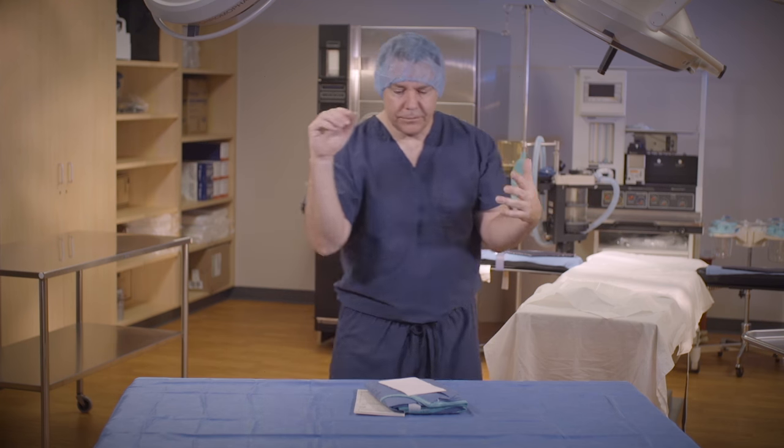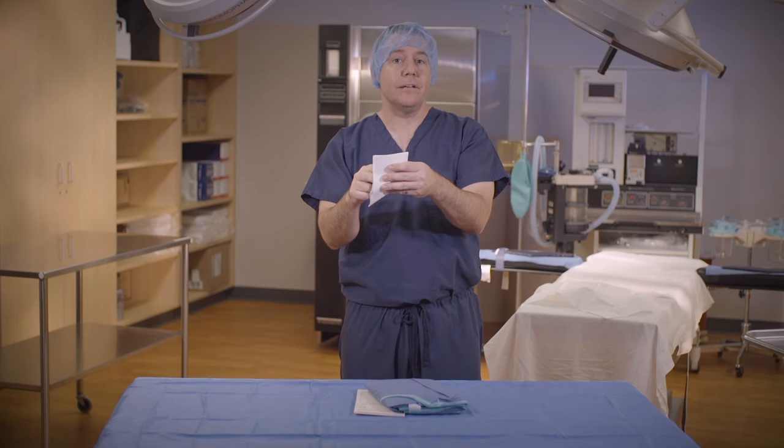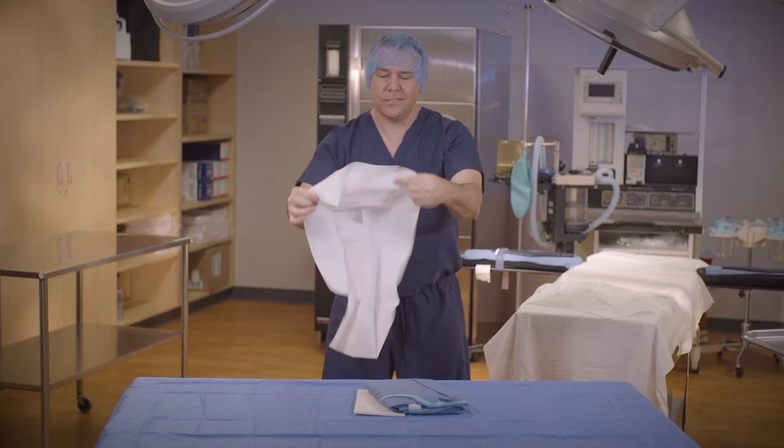Bending at the waist and keeping the elbows bent, pinch and lift the towel from the sterile field with the right hand without dripping or touching the sterile field. At this point, I'm going to back away about three to five feet, making sure the towel does not touch my scrub top. And then I bend slightly at the waist so the towel doesn't touch.